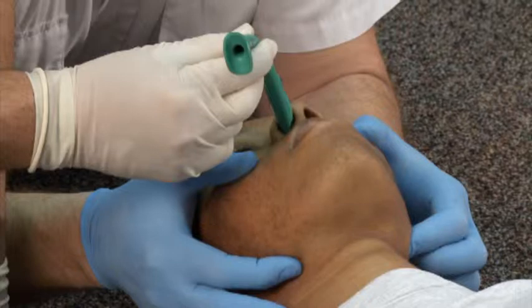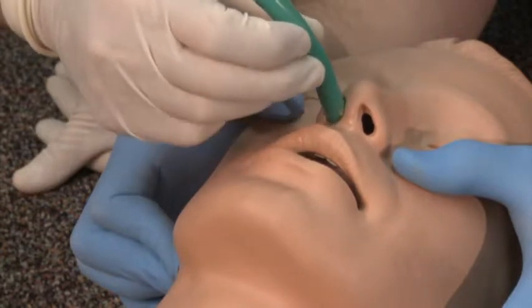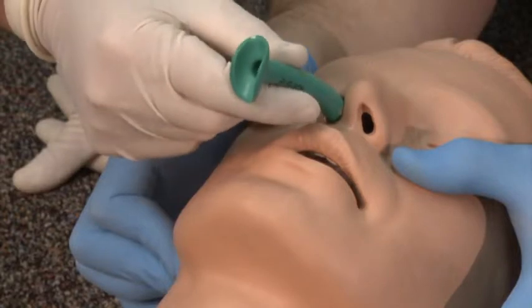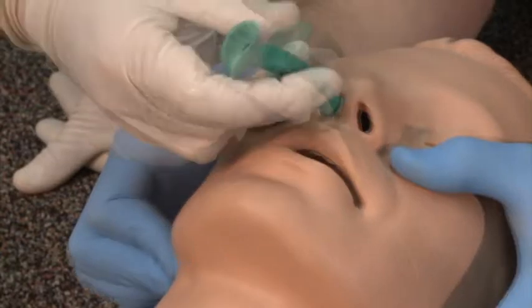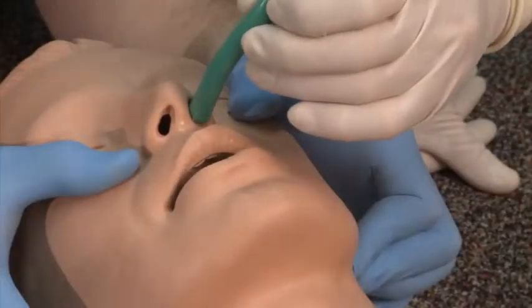If resistance is met at the posterior end of the nostril, a gentle rotation of the NPA between the fingers will usually aid in passing beyond the turbinate bones of the nasal cavity without damage. Should the NPA continue to meet with resistance, the provider should not force it past the obstruction, but rather should withdraw it. The distal tip should then be relubricated and inserted into the other nostril.